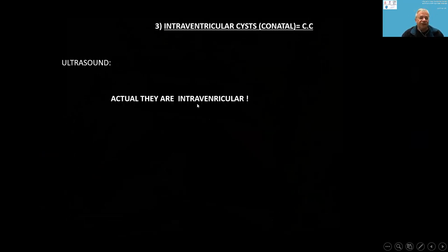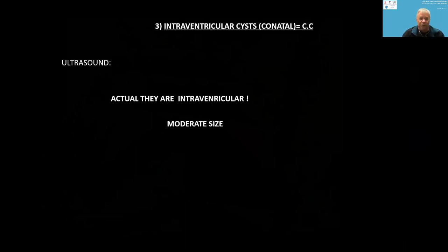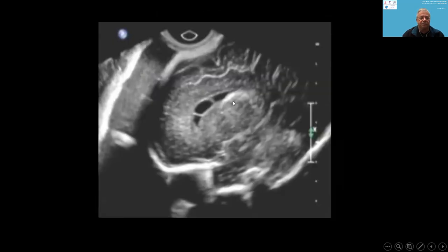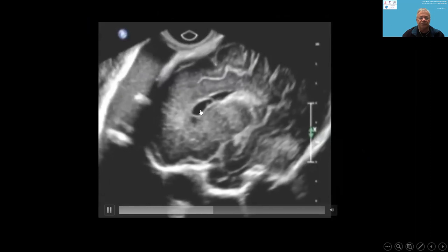The third group is intraventricular cysts — I call them conatal cysts. On ultrasound, they are actually intraventricular, not periventricular. They appear like small grapes in the anterior horn, in the third trimester. Here they are shown on MRI and ultrasound.